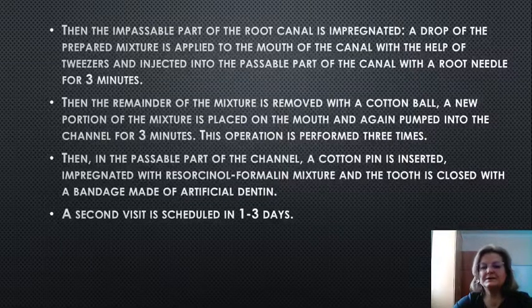This operation is performed 3 times. Then a cotton pin impregnated with resorcinol-formalin mixture is inserted in the passable part of the canal, and the tooth is closed with a bandage made of artificial dentin.